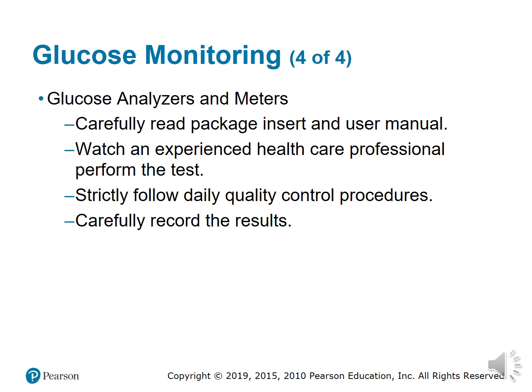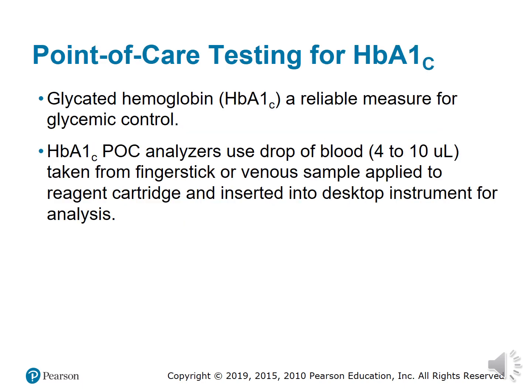Always watch an experienced healthcare professional perform the test, especially if you've never done it before. Strictly follow daily quality control procedures, meaning every time you change the battery, make sure you do a quality control test on it to make sure that it's reading appropriately. Every time you clean it, you have to do another test on it, and carefully record the results after you have completed the testing.